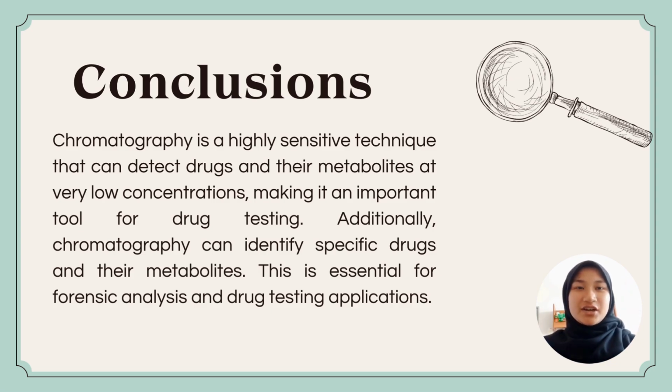As we have seen, chromatography is an indispensable technique in the field of drug testing. By separating and identifying compounds within a mixture, it allows for precise detection and quantification of drugs and their metabolites in various biological samples. Techniques like gas chromatography mass spectrometry, or GCMS, serve as the gold standard, providing unmatched sensitivity and specificity.